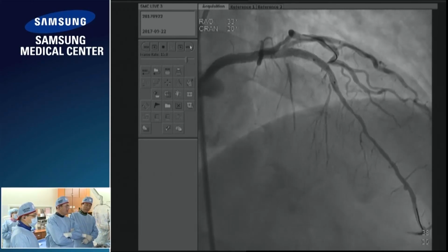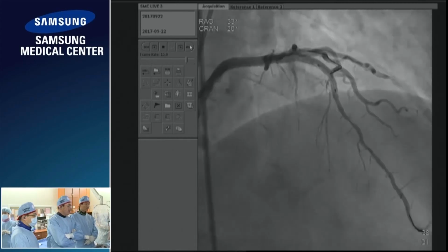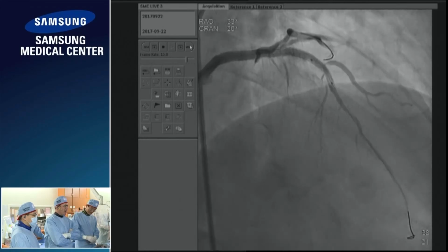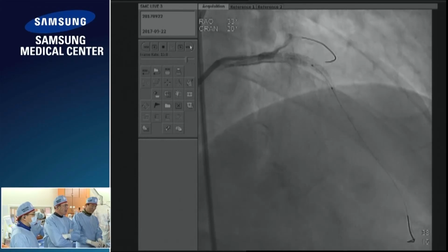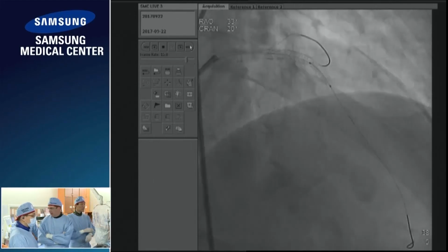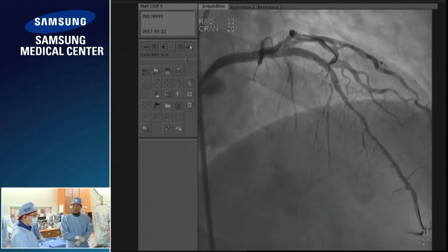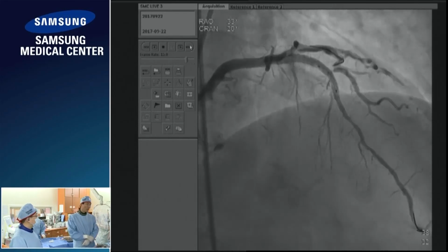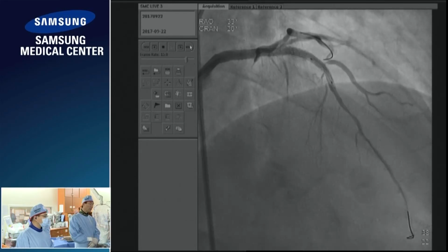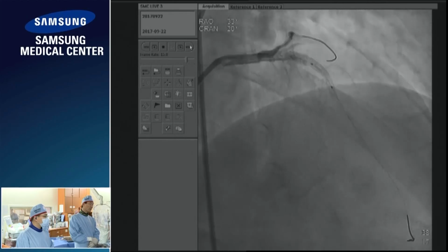But we agreed to disagree, and agreed that we would consult the panel. I just wonder if there's anyone on the panel who would treat this segment. We did get some extra information from the OCT, and I'm going to show you that now. Meanwhile, what do you think? Do we need to treat the distal LAD, or would you like to treat with DES or DCB?